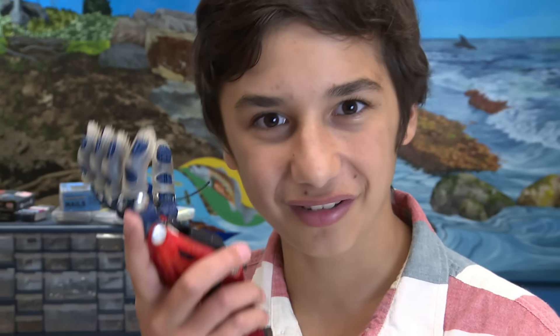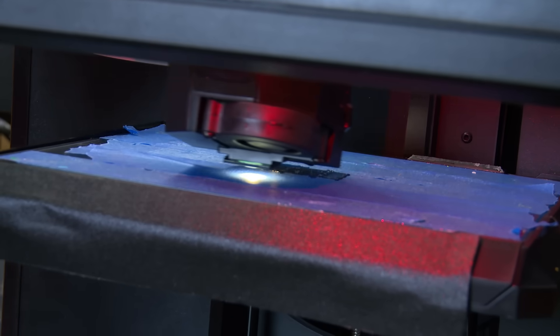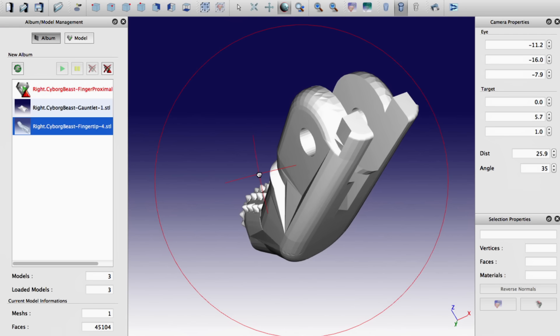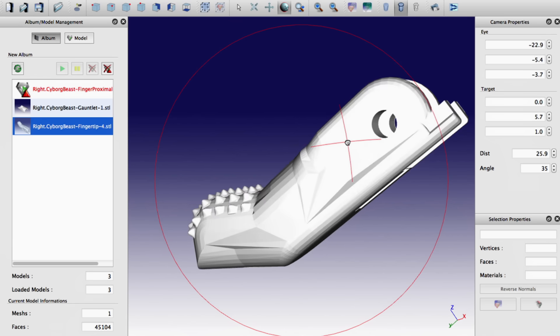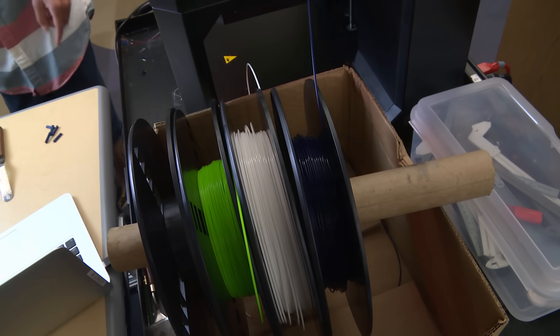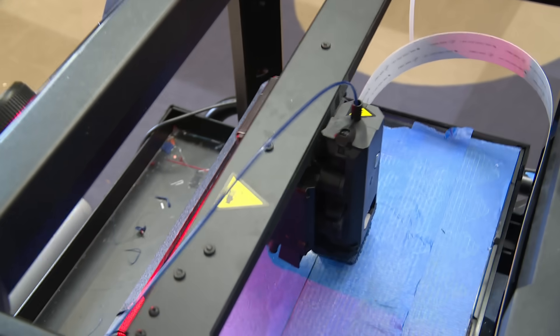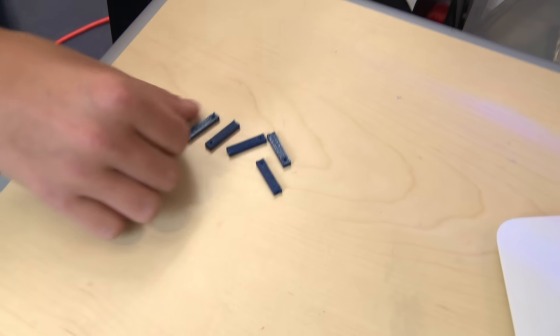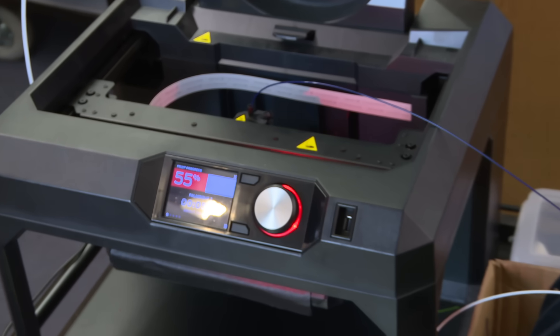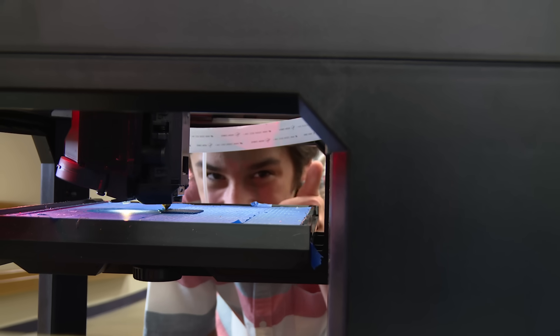We built the Cyborg Beast using a 3D printer. This is a 3D printer, and this is the computer that's sending a computer file to the 3D printer telling it what to print. These are spools wrapped around with plastic that's being melted on this little extruder. What's cool about a 3D printer is you can build a three-dimensional object with a computer file of the object. The machine prints layer by layer by layer using liquid plastic.